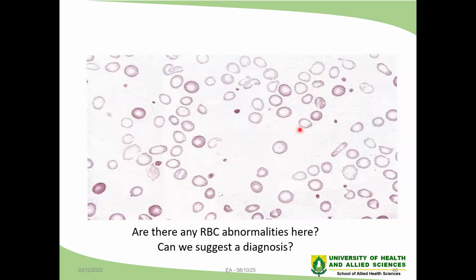In this particular patient, we also have anisochromia. If we look at the film, we realize that apart from the hypochromic cells, we have some cells which are almost nearing normochromia in terms of the amount of hemoglobin.